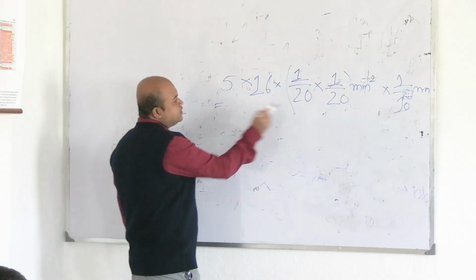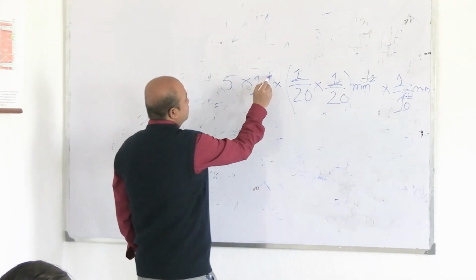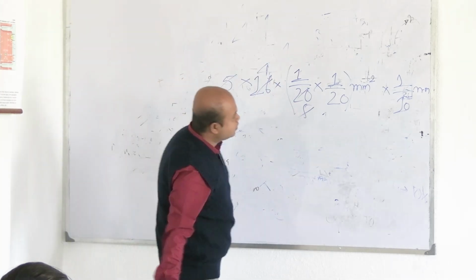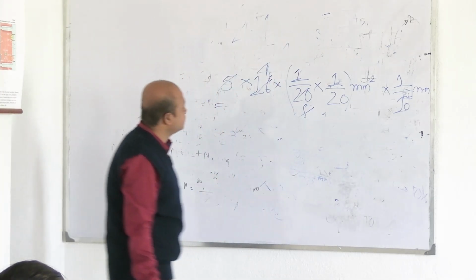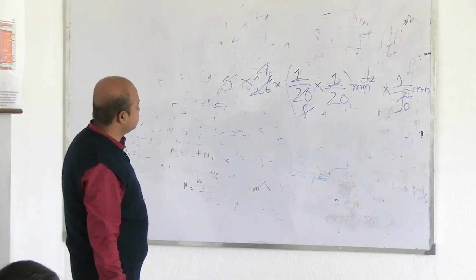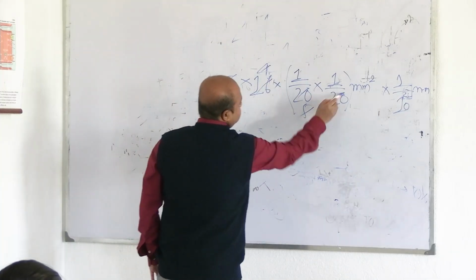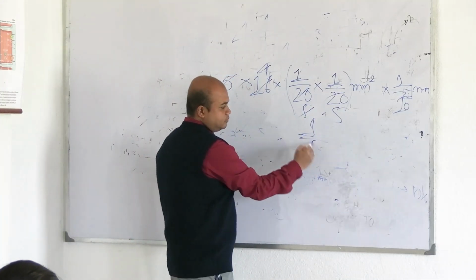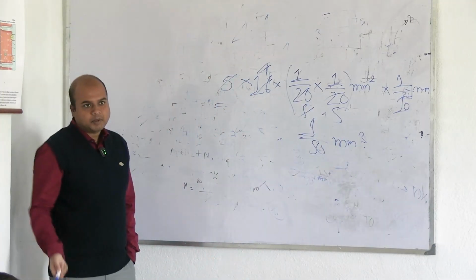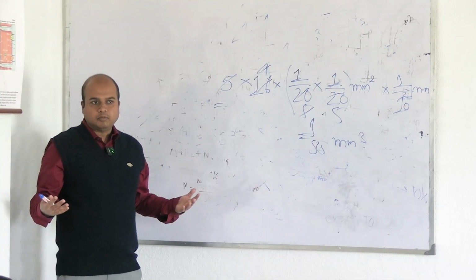and see this will again come to, it has to come, that is 4, this is 5. Is it? Have I made any mistake? Yes, 1 by 50. So don't memorize anything. I have not memorized anything. It's 1 by 50. It will come to 1 by 50. So I am counting this volume.